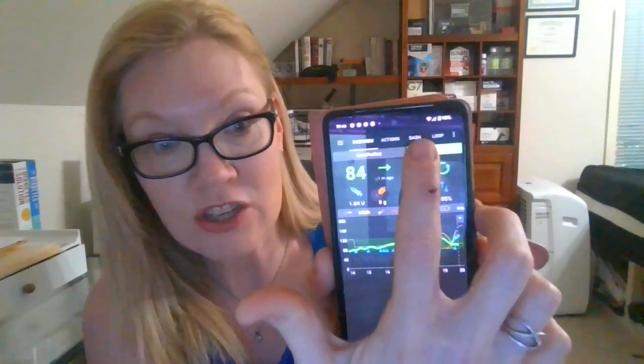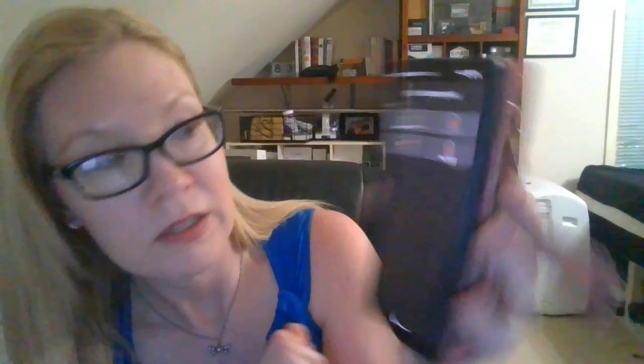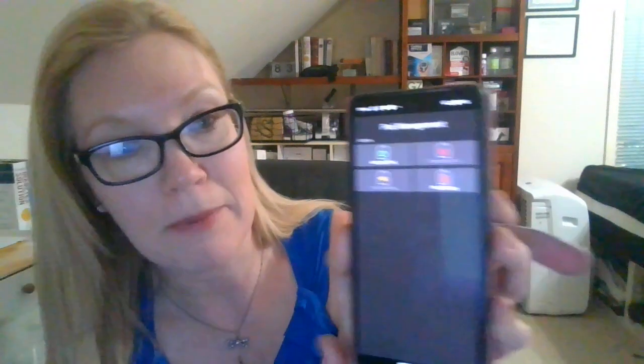So what I'm going to start out by doing is going into my APS app right here, and I'm going to go to Dash, then pod management, and then I'm going to say activate pod.